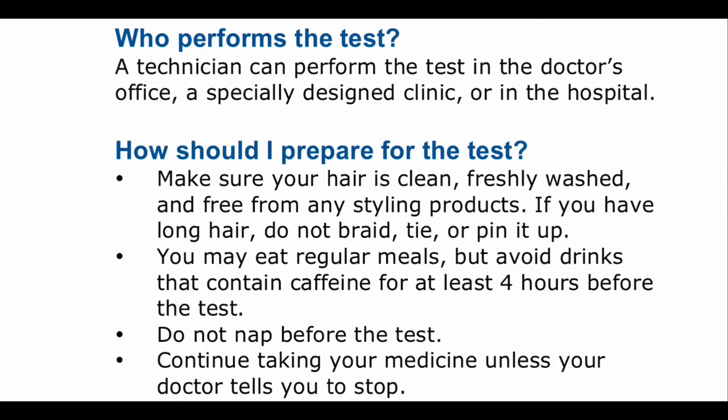And you may eat regular meals, but avoid drinks that contain caffeine for at least 4 hours before the test, because caffeine can affect your brain waves, which would also affect the test. And do not nap before the test, because most of the time we want you to fall asleep for at least a portion of the test. And continue taking your medicine unless your doctor tells you to stop.